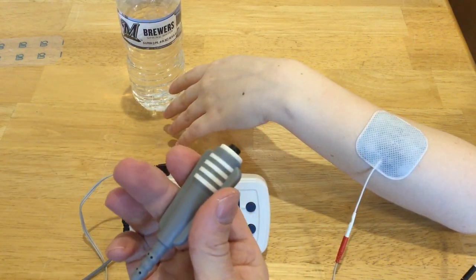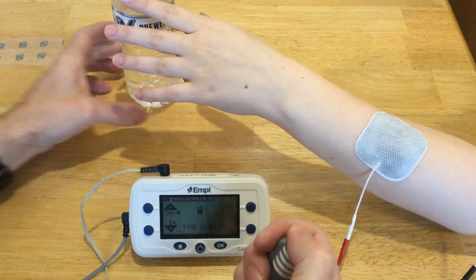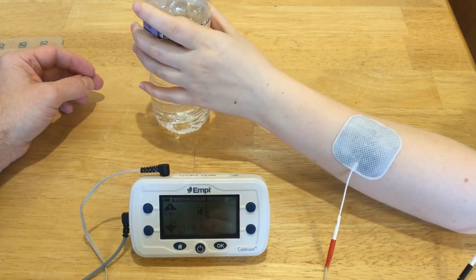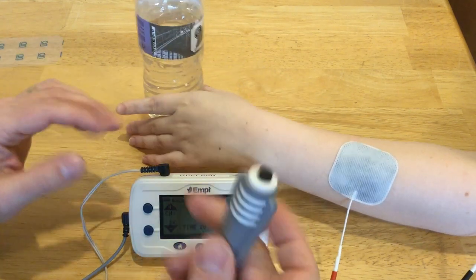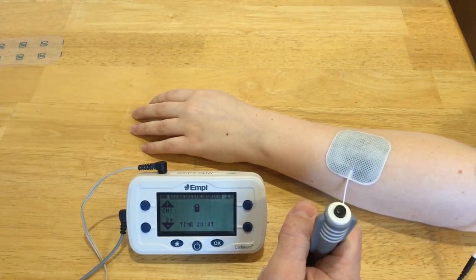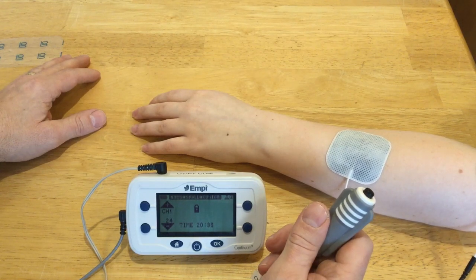With the use of a switch, I can say I want you to grab the bottle, and with the switch I can extend the wrist so she can reach and grab the bottle. Then I can release the wrist extensors when we're done with the activity. Using a switch like this in conjunction with NMES is called FES, or Functional Electrical Stimulation.